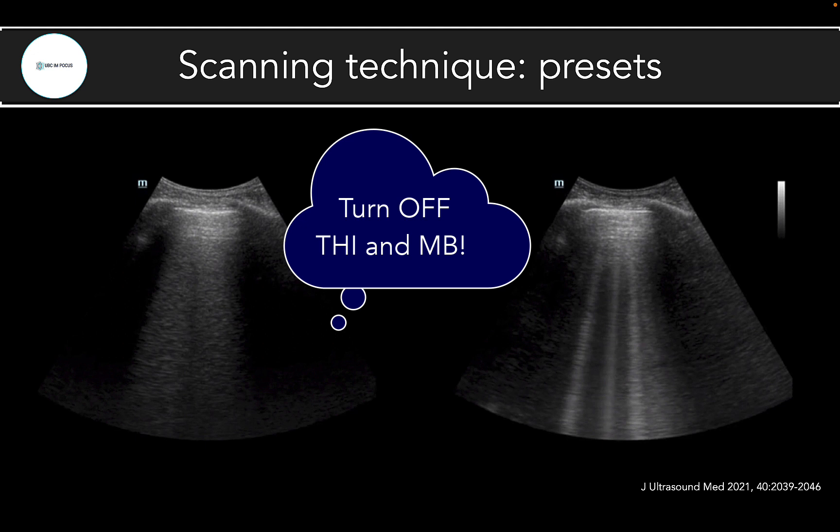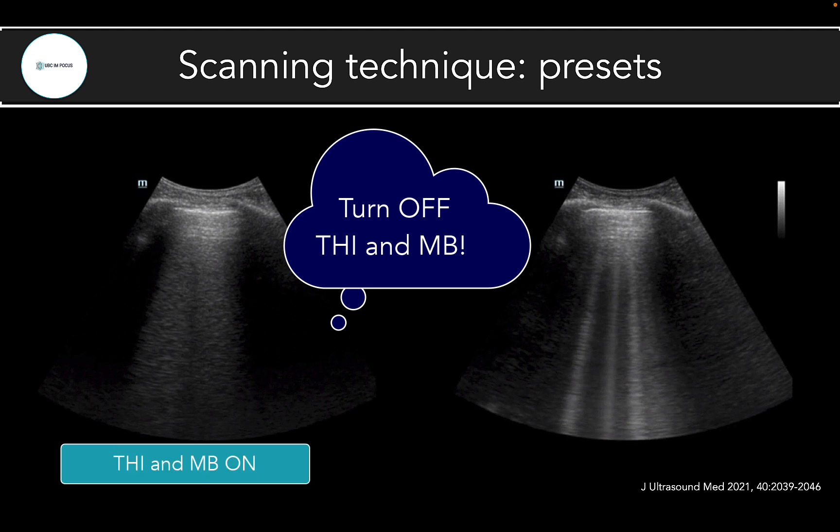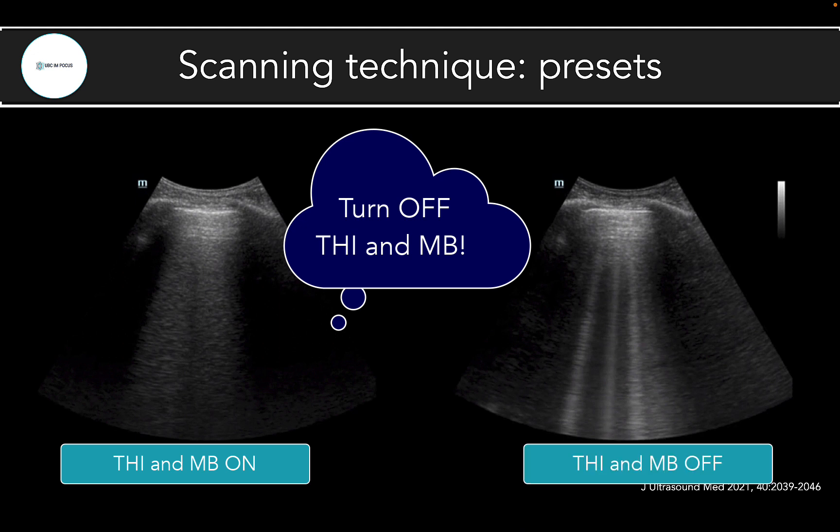Here's a comparison of the same image: the left-hand side uses a traditional abdominal preset with THI and MB turned on, while the right-hand side has these two settings turned off. You can see the B-lines are much crisper and better defined on the right.